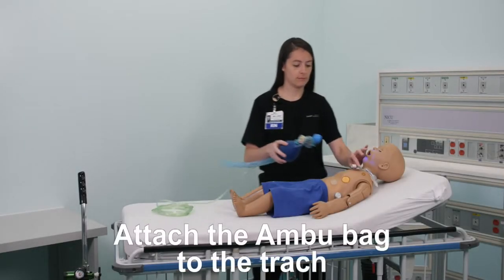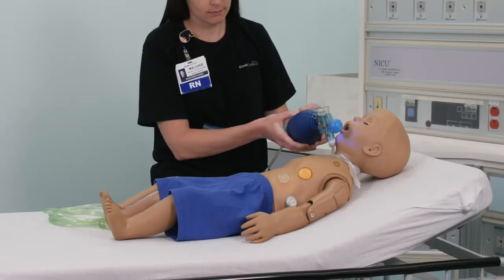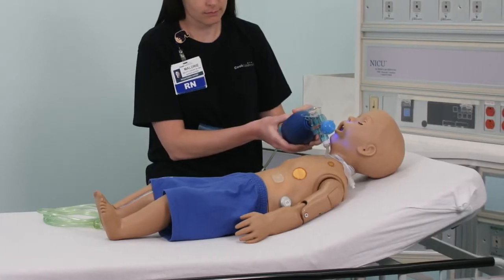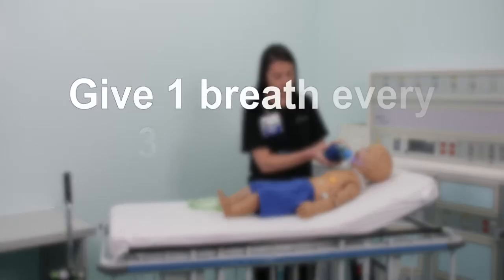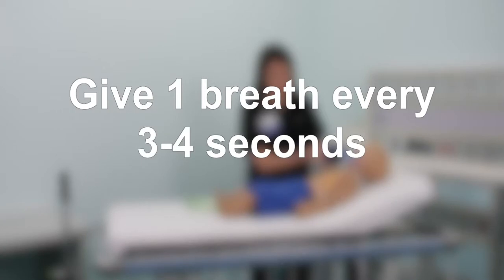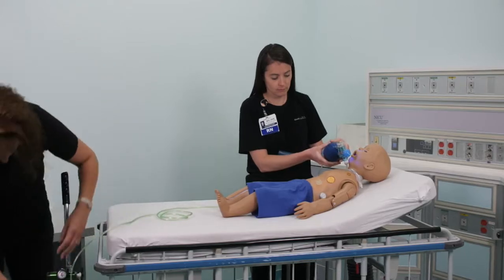Attach the ambu bag to the trach. Squeeze the bag until you see the chest rise. When breaths from the ambu bag make the chest rise, you know your child is getting enough air. Give one breath every three to four seconds. If you have a second person, ask them to attach the ambu bag tubing to the oxygen and turn the oxygen to the highest setting.